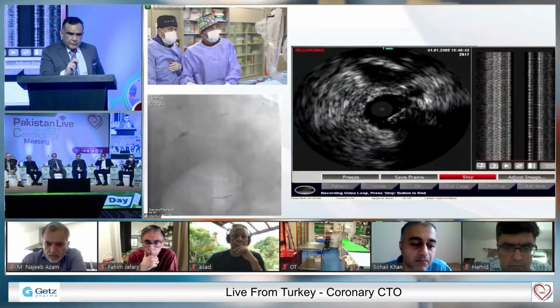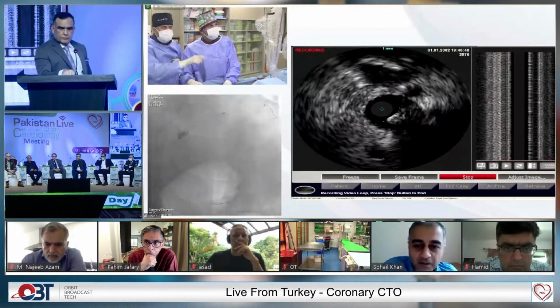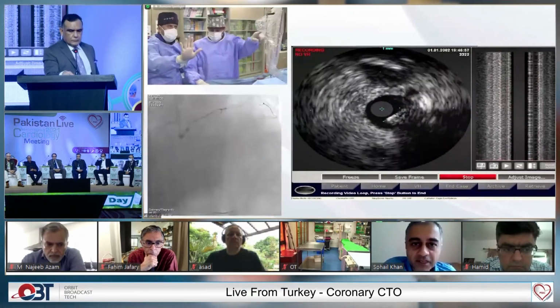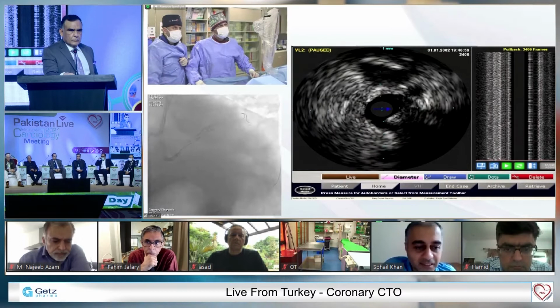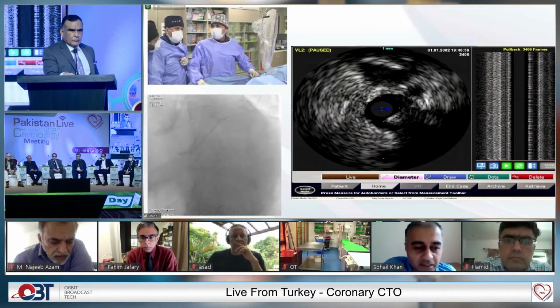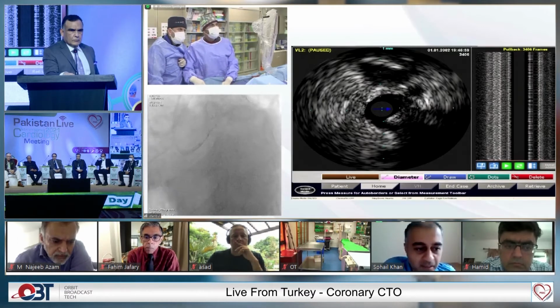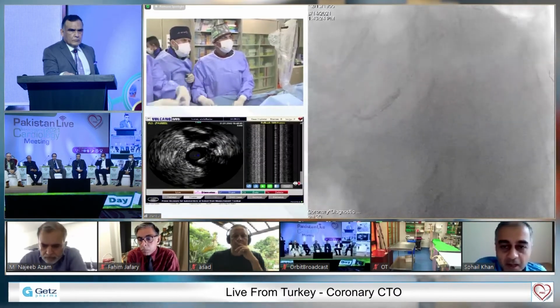Yeah, thanks, Nadeem. Good to see you. Just a few things to say, and I think it's useful for the fellows as well. Taking things back a step, what we're demonstrating here is a LAD CTO, an attempt to open up this LAD. This patient would really benefit from this procedure. We know that LAD CTOs cause ischemia, and this patient would have been in some difficulty with the RCA as well.